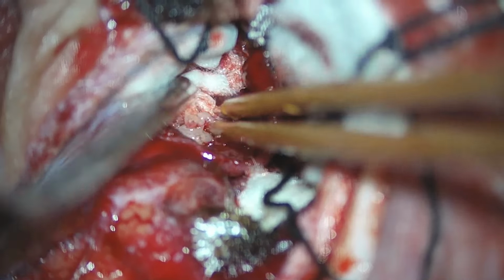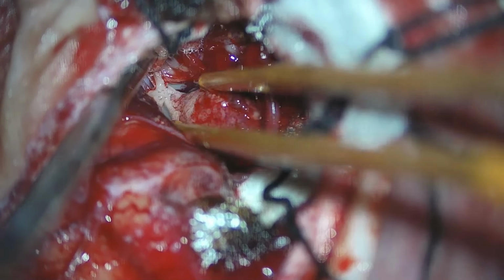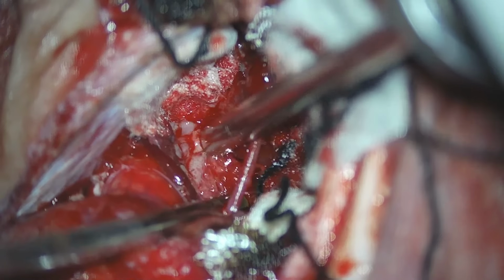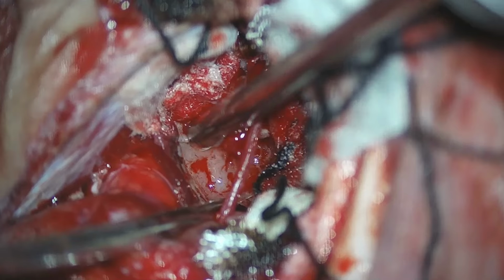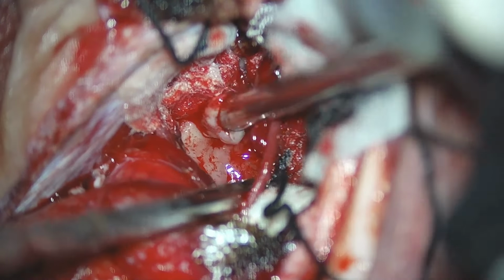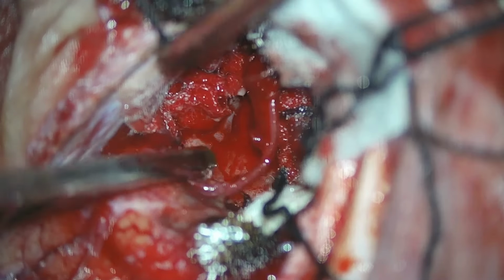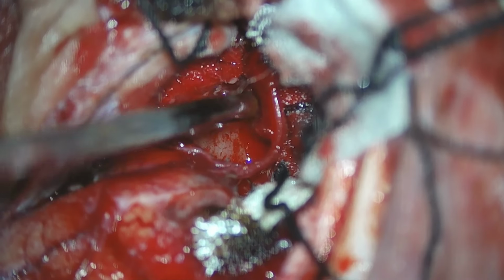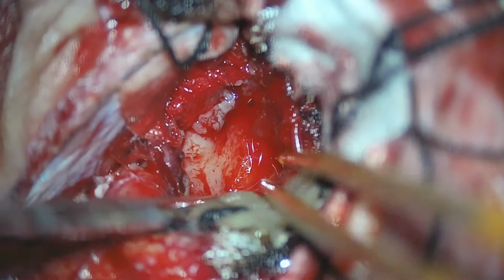We can see the tumor along with the necrotic areas that are present here, which is slowly being separated from the normal brain using a bipolar, and we are debulking it with a debrider. Once a good amount of debulking is achieved and we enter the base of the tumor, we slowly start removing it with tumor holding forceps, and also achieve hemostasis at the same time using a bipolar.